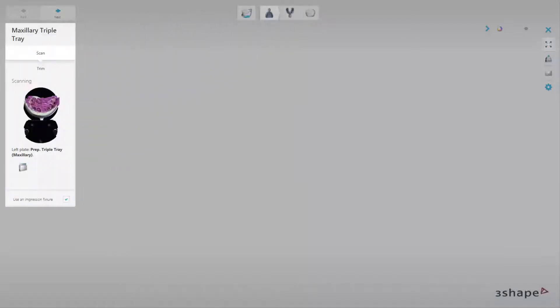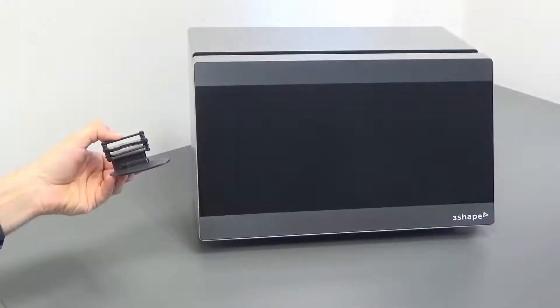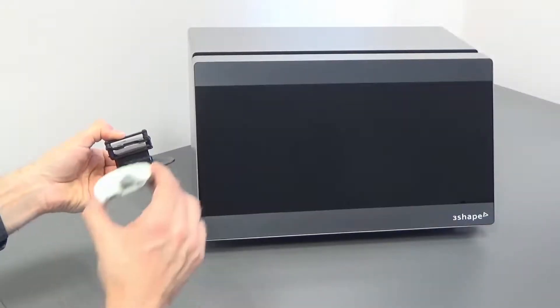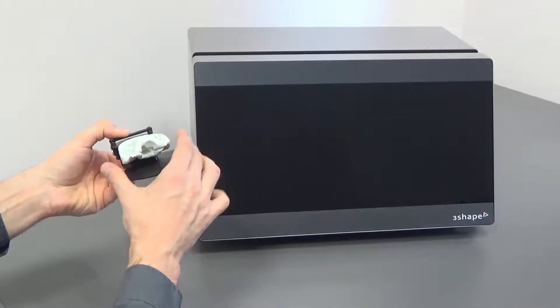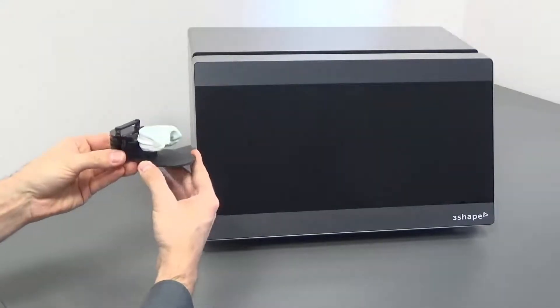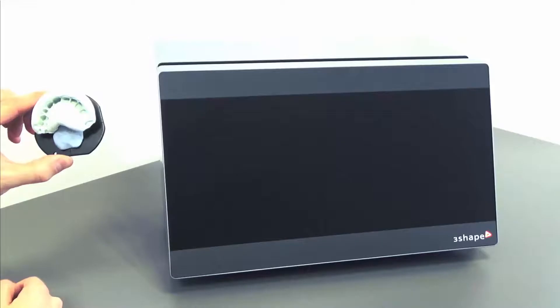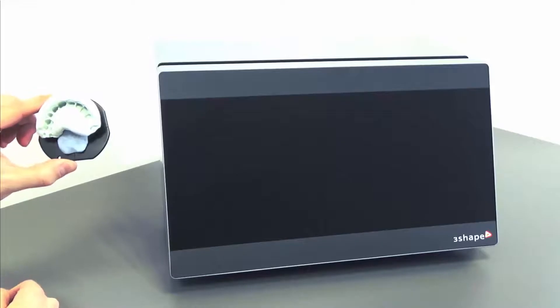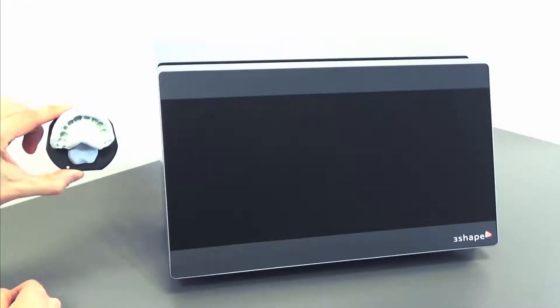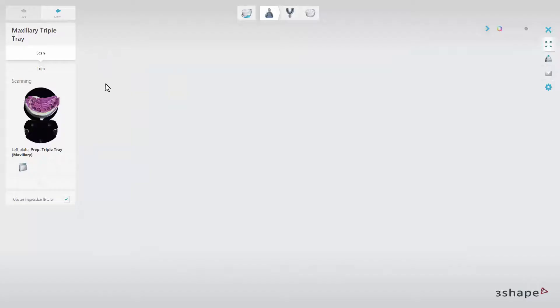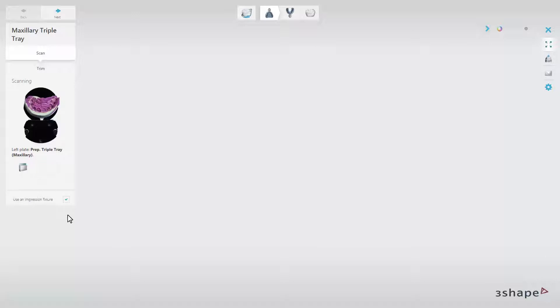The overview window will display scanning information. While scanning impressions, you have the possibility to scan with the use of an impression fixture or without. Scanning without an impression fixture can be done using BluTAC the same way you would use it for plaster models. To change between those two options, unmark or mark the option box.